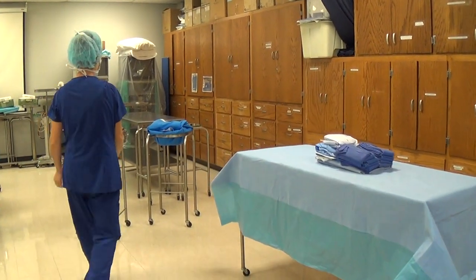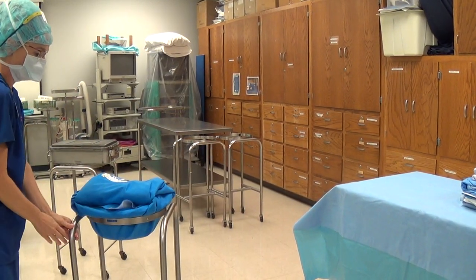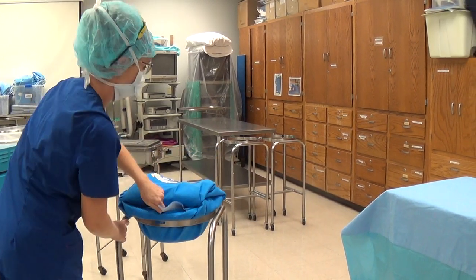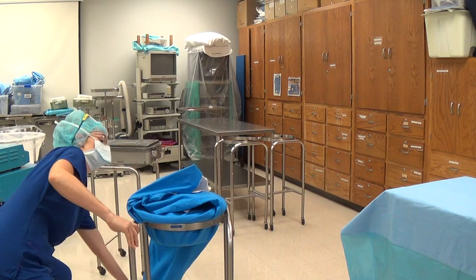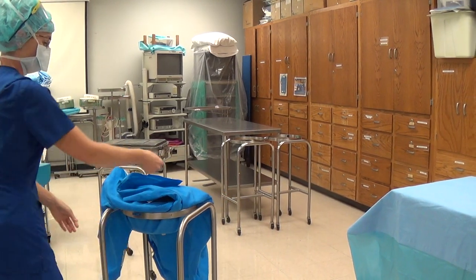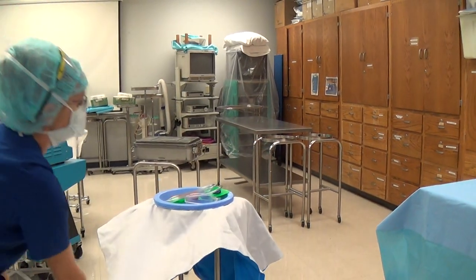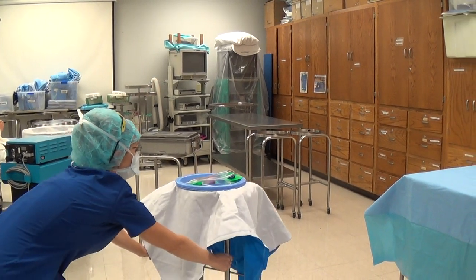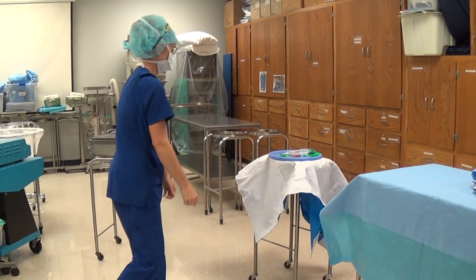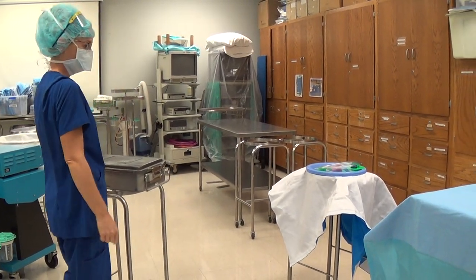Next she will go towards her ring stand and her genesis stand, staying 12 to 18 inches away from her back table. That first corner is facing toward you, opening away. Notice Casey's standing to the side of her ring stand — just grabbing each corner and going straight down. Make sure you're not going out toward your back table. Bending at the knees, not at the waist, Casey's going to grab below the wrapper to move it 12 to 18 inches away from her basin. You can't have it right next to the back table because they are not the exact same sterile level.